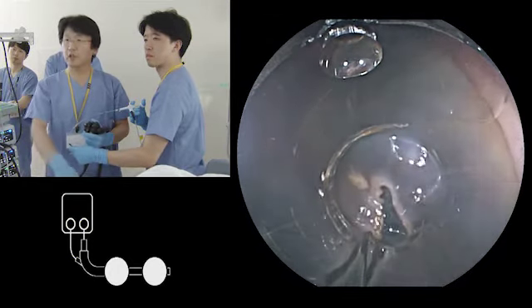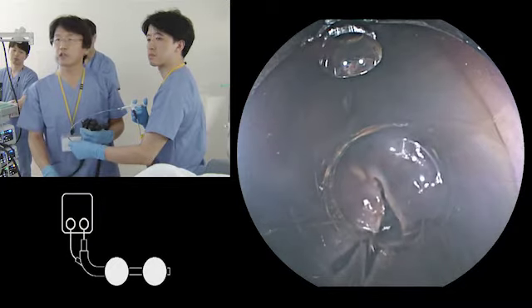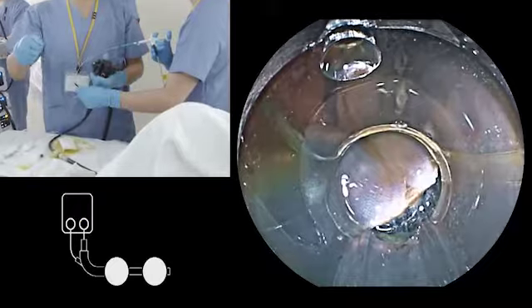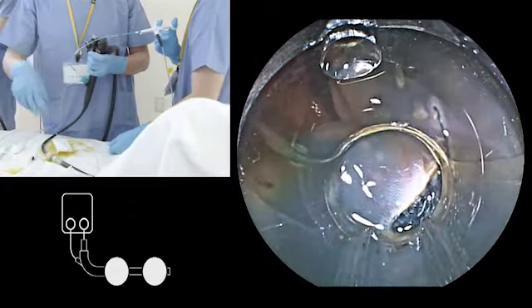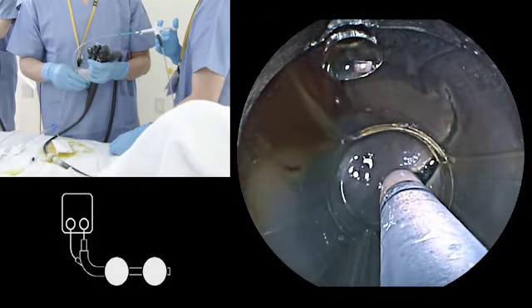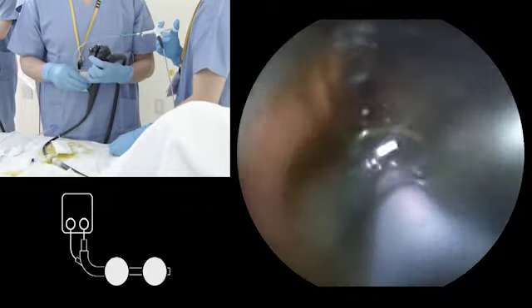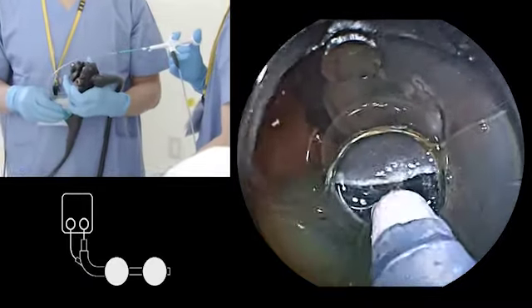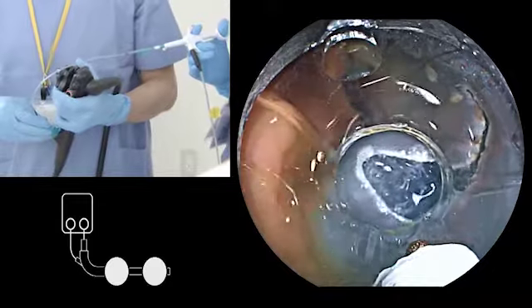And I just place the overtube on the table because it's stable already, so I don't need to push in and out very often. And sometimes I just leave the endoscope there and I control the knife myself, and then I cut like this. Okay? So about 2 centimeters. After mucosal incision, I start dissection.